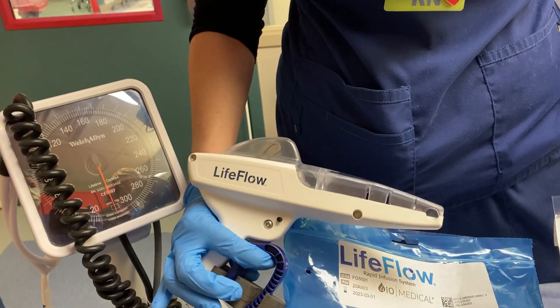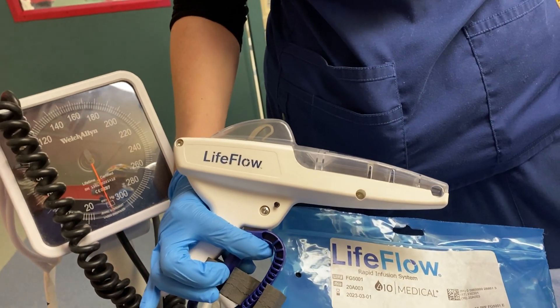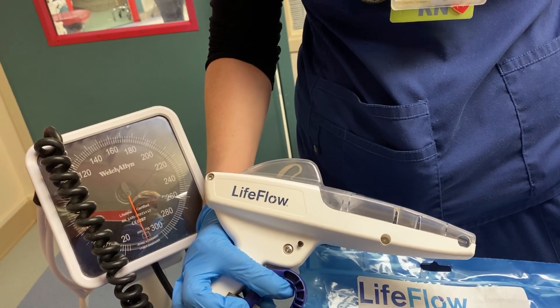This is the Life Flow, and it will let us pump in fluids very rapidly. His blood pressure was like 88 systolic and he's tachycardic, and I need to give him a fluid bolus quickly.